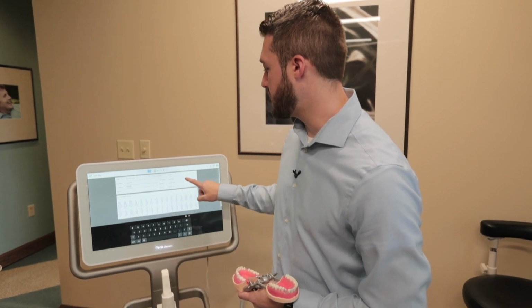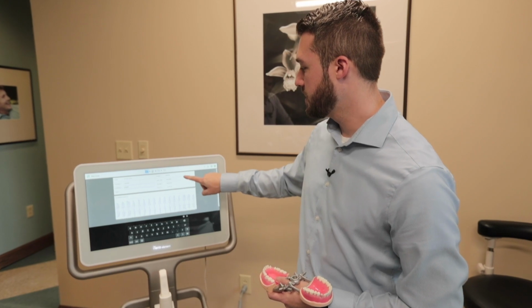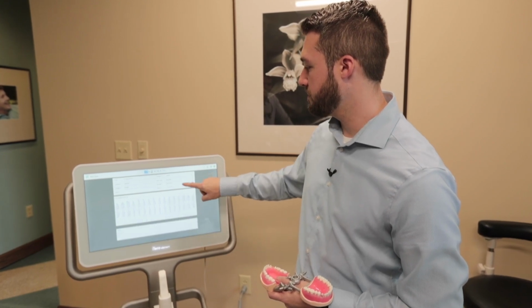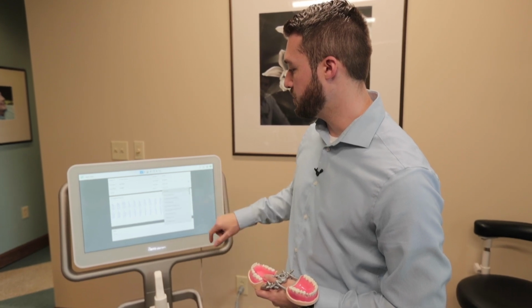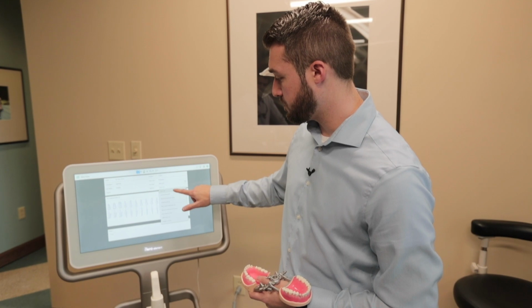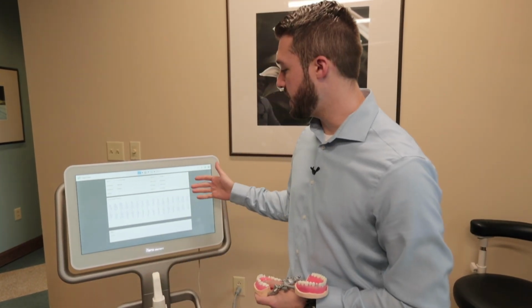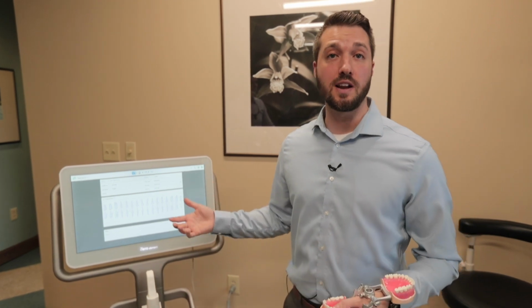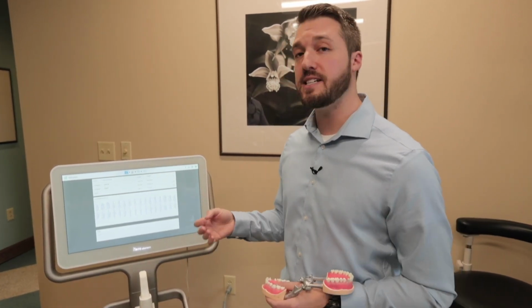We're then going to drop down. If it was a patient that existed, it would automatically link to their account. We're going to go to restorative. We're going to select the due date, so whatever our laboratory due date is, and then we're going to choose our laboratory. So we have a drop-down box with the labs that you use. When a doctor buys a scanner, we ask them what labs they use. So when you get it, you only have the list of the laboratories that you want. So you don't have every laboratory that's in our database that can confuse you. It's designed to be easy and simple.